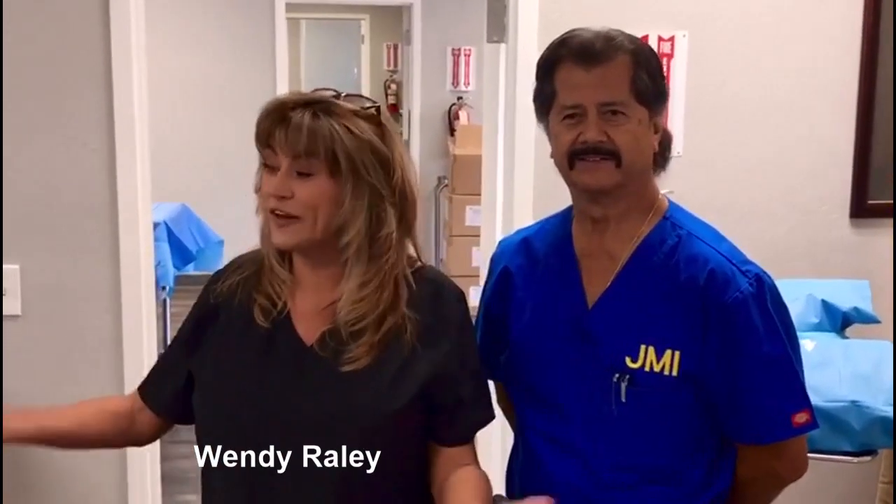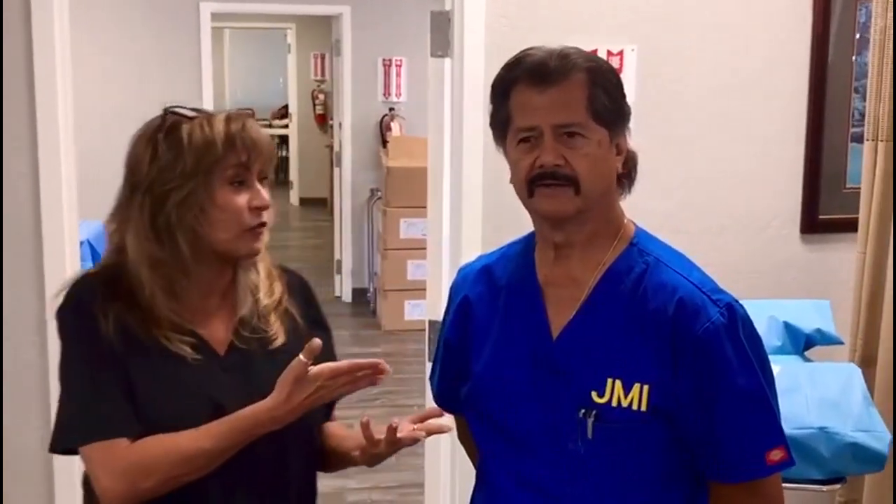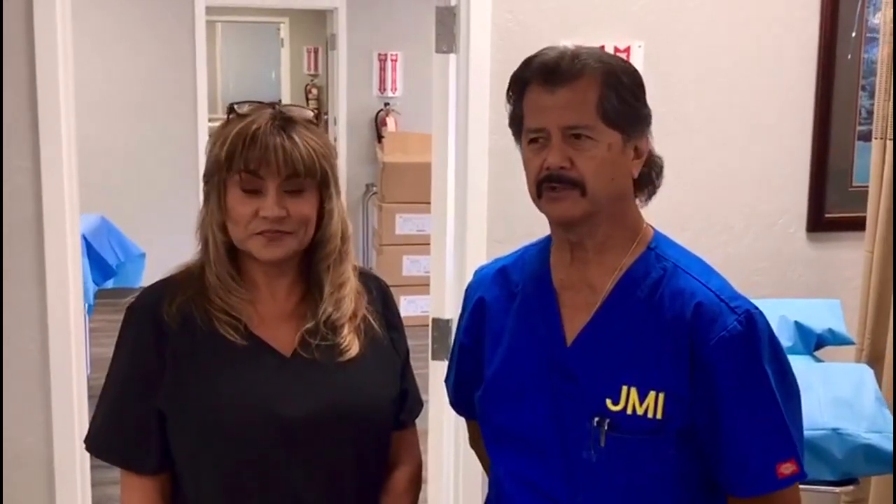I'm Wendy Raley from Altamont Healthcare here in Stockton. We're doing a lab today for our surgical tech students. I have with me John Sturda. I'm a practicing and registered first assistant at Lodi Hospital. We're here at Altamont Healthcare with the vocational tech students for surgical technology.